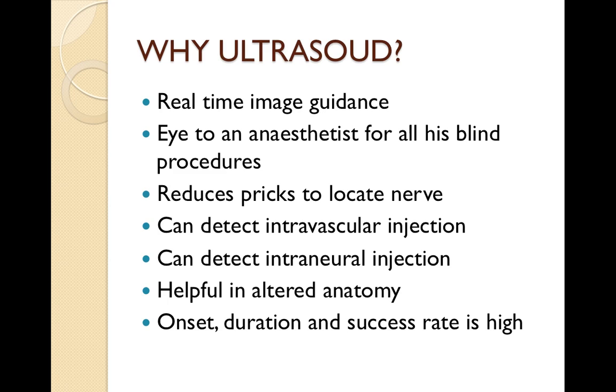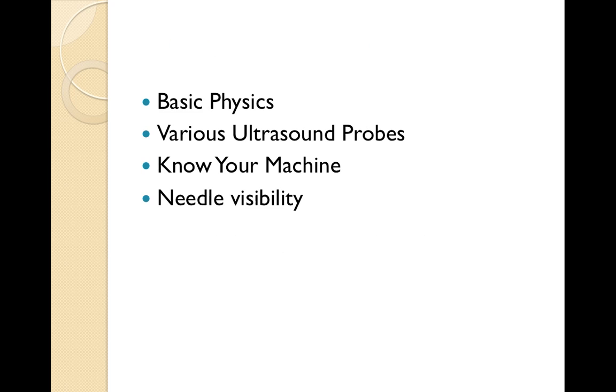It has been studied for onset time and duration with the ultrasound guided technique. Regarding duration, we have observed that after starting ultrasound guided blocks, the duration of the block is quite longer when we compare it to previous blocks.